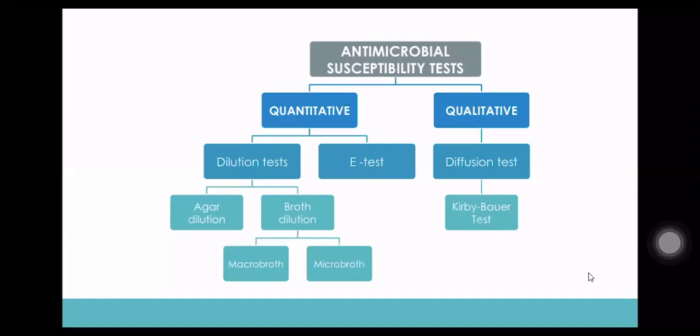Okay. So, dilution test. For dilution test and e-test, this test can give quantitative results. Sa dilution test napa-under si agar dilution and broth dilution.